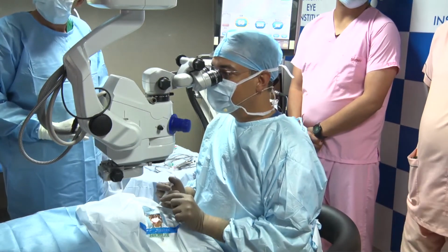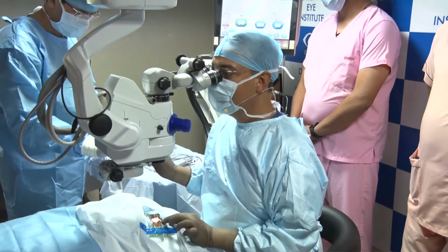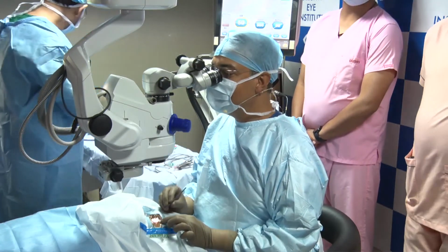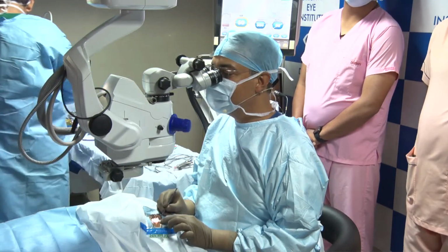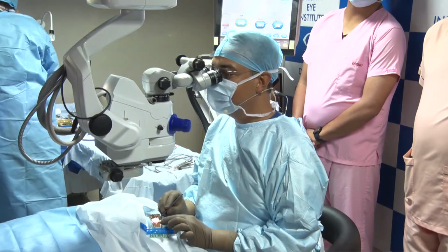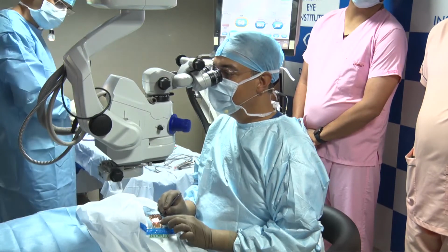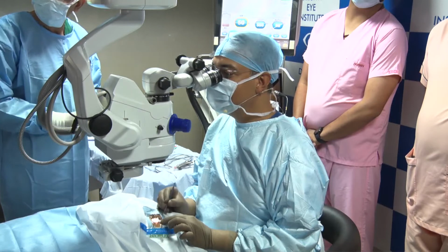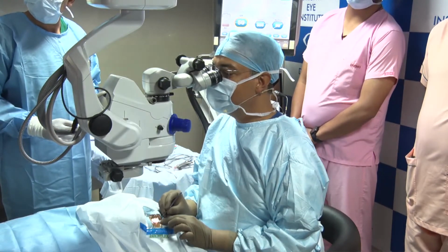Right. And what is the minimum, when you go in for the minus IPCL from the refractive error point of view? I am now using ICLs and IPCLs for small powers like minus 3 and 4. Sometimes when a patient is not fit for refractive surgery because of a suspect cornea, or because of some reason we can't operate on the cornea, like corneal issues. So I don't hesitate now to do ICL or IPCL even for smaller powers of 3 or 4 diopters, and we often do it.